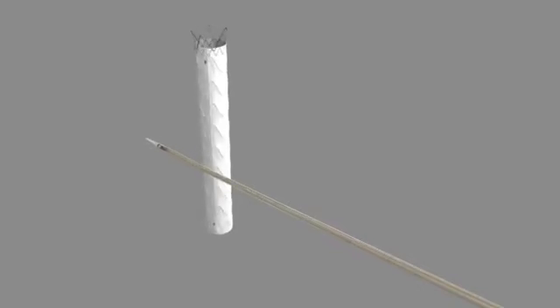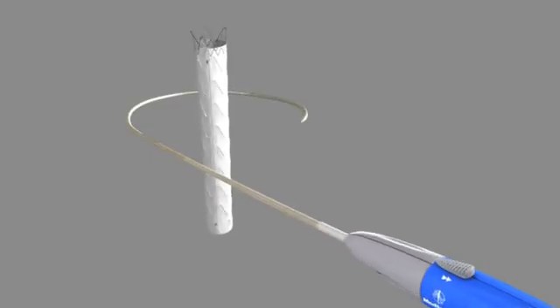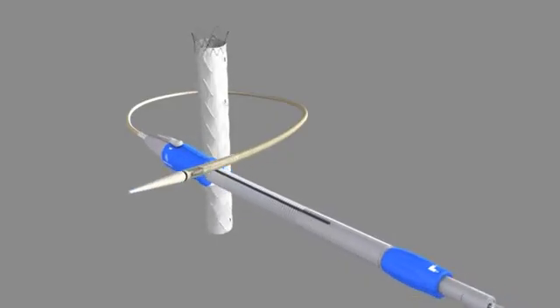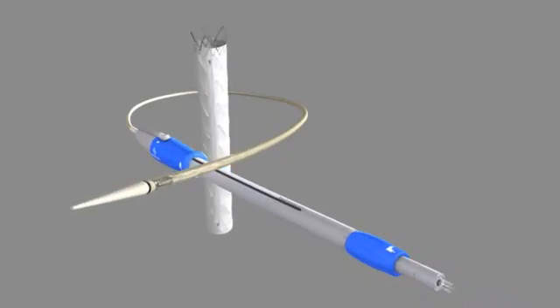This animation provides an overview of the Talent thoracic stent graft with the Captivia delivery system. Please reference the instructions for use for a detailed list of indications, warnings, precautions, and potential adverse events.